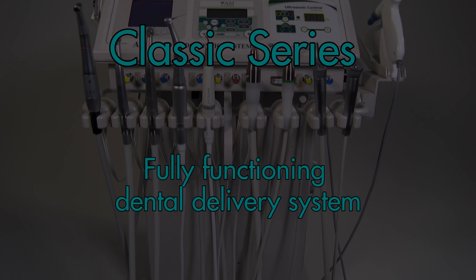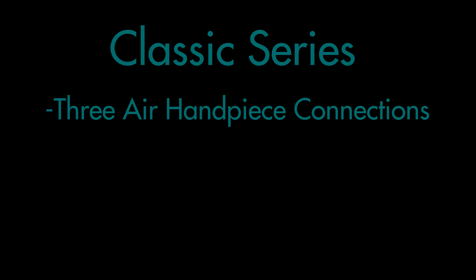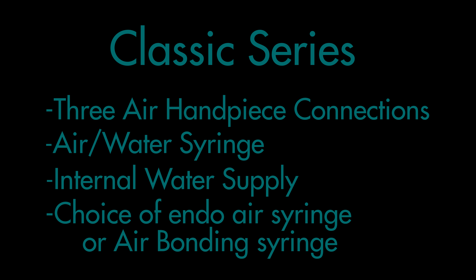The Classic Series is a fully functioning dental delivery system with three air handpiece connections, air water syringe, internal water supply, and choice of an endo air syringe or an air bonding syringe.